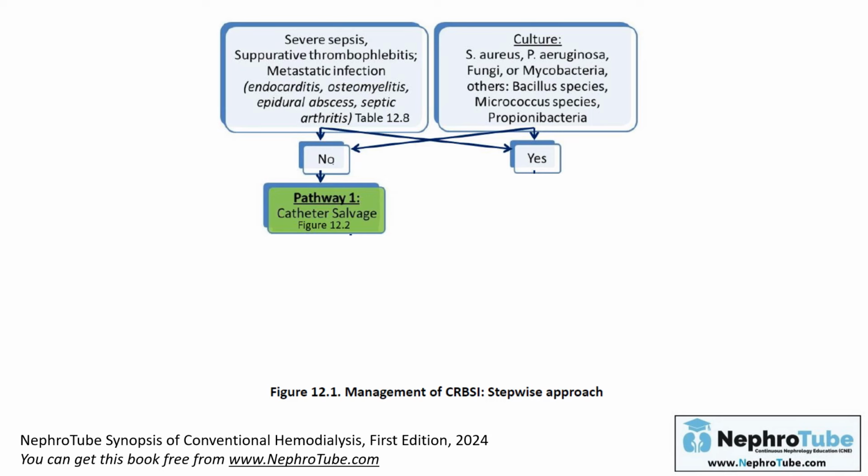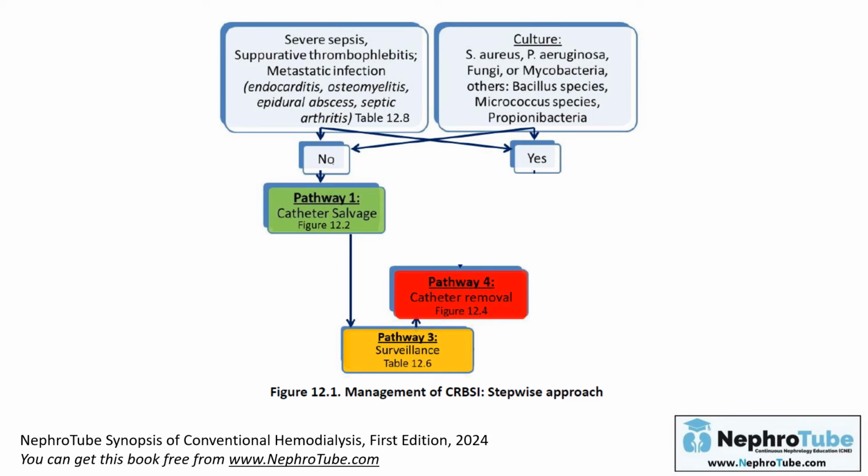After catheter salvage, there is another pathway I will mention in detail later, about surveillance. Then a pathway about catheter removal.